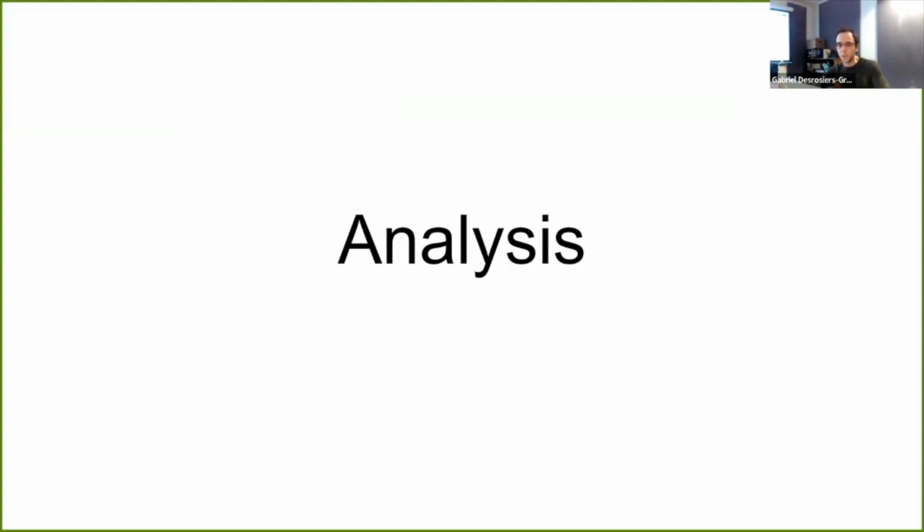So you can't just provide one, and you just need to be aware and specify in your paper that you've said white matter signal regression, but actually this stands for white matter, CSF, and so on. So you just need to document it well. Thank you.